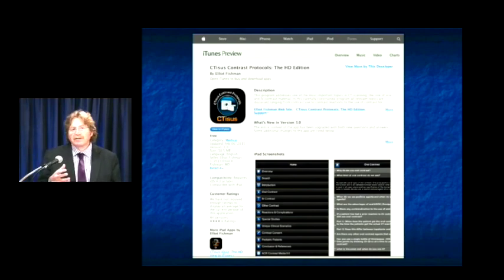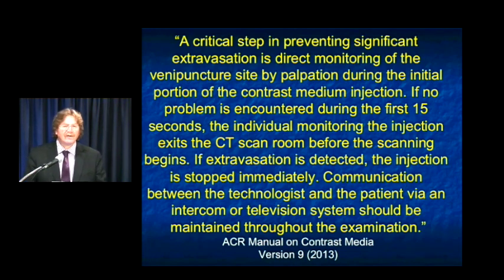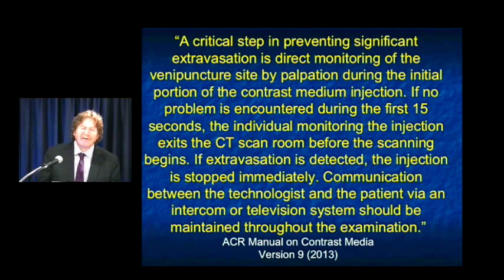But let me just go through some of the important things about IV contrast. So one is, if you ask me what I'm concerned most about in CT, what are the scariest things to me, I do worry about contrast reactions, but with contrast agents like Visipaque and Omnipaque, it's rare, knock wood on the podium, it's very rare to have any issues. What worries me with fast injection rates is contrast extravasation.